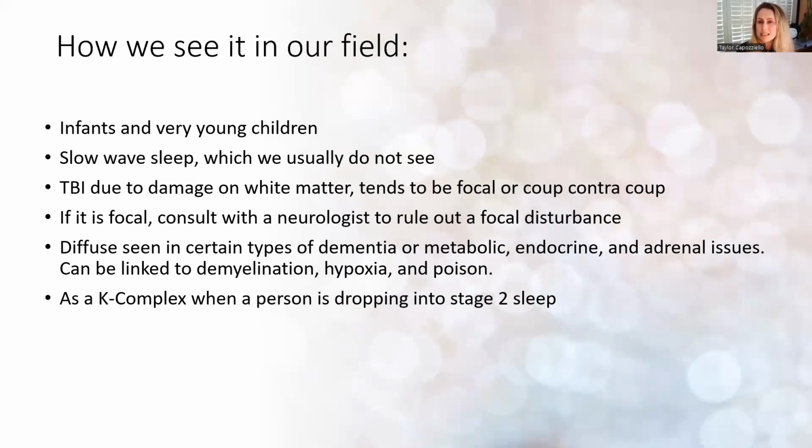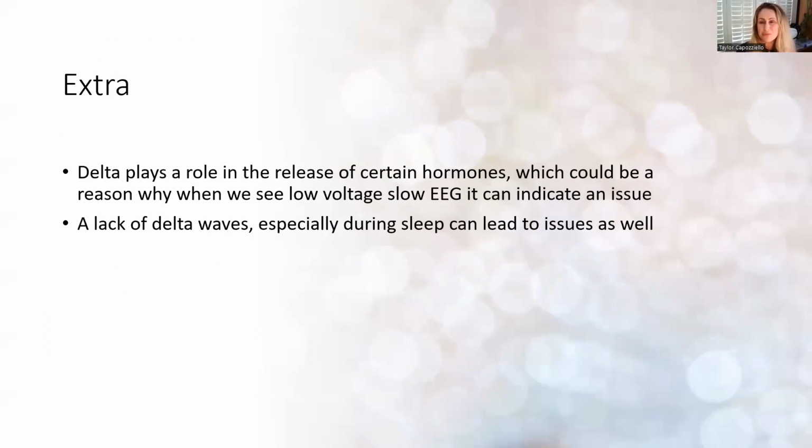I include it because Niedermeyer includes it in as the delta. I always like to add a little extra because when I'm going through this, I feel like there's more things that we need to know about that. And so this is also the area that I really want to grow within our field and keep adding into it how other people see it, and either cite that or cite the research that's currently being done on it, or if it's a hypothesis.